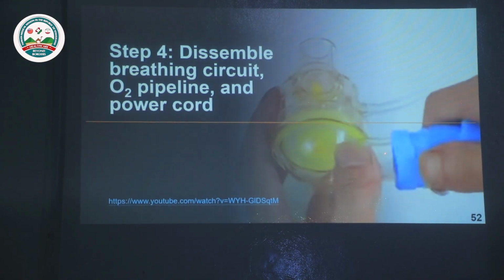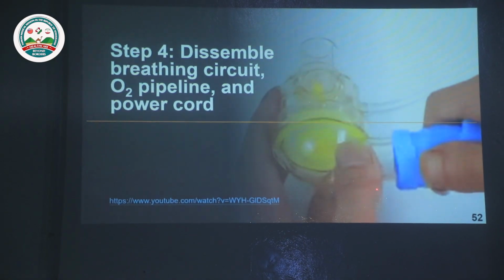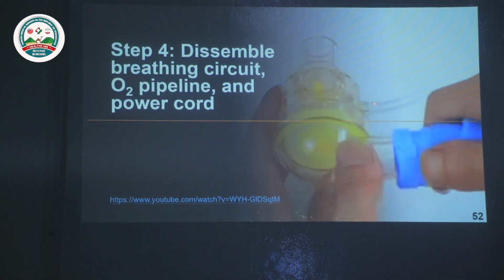Sometimes, because maybe you just used this circuit for 5 minutes and you have a bacterial filter connected, you can just use alcohol for cleaning. But if this tubing is too dirty, you need to do cleaning and disinfection.